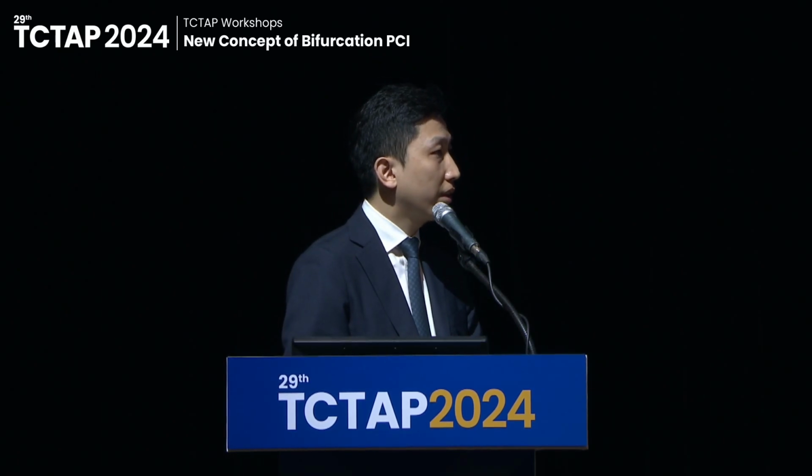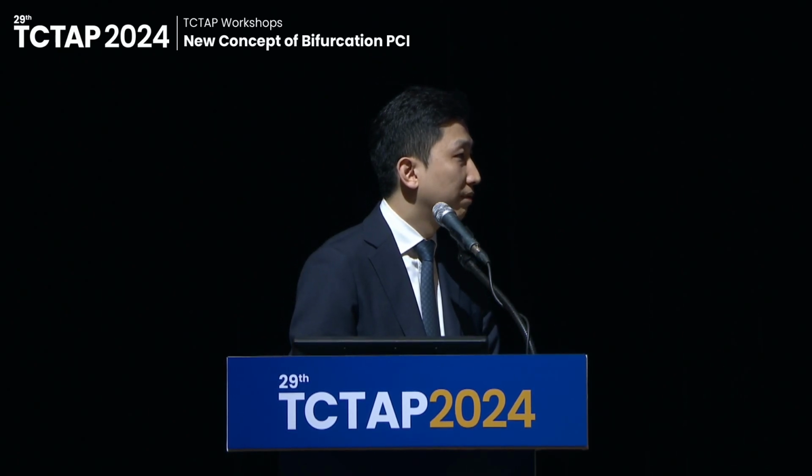So Adrian, any further comments about that issue? I think what I liked was the emphasis on the dilatation at the weak point of the bifurcation, that twice you made sure that you'd expanded the side branch ostium, first when you put your first stent in, and then again with sequential balloon inflation. Because I think that's the weak point that people, again, don't spend enough time on. So I thought that was great. But when you say mini crush, it's a mini, mini, mini crush, huh? How many millimeters do you expect? Or are you trying to make it absolutely flush?